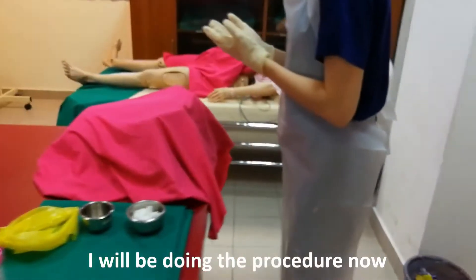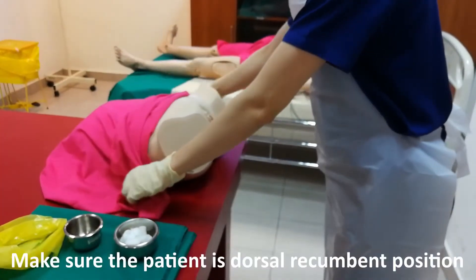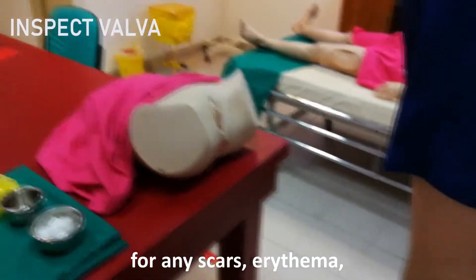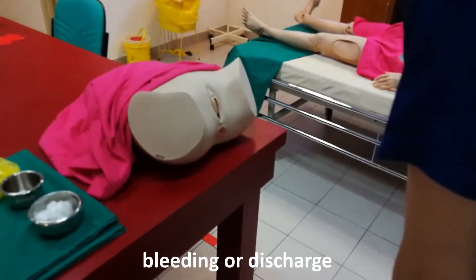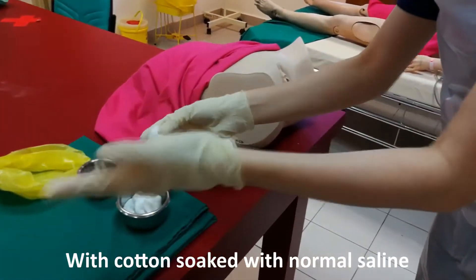Madam, we will be doing the procedure now. I would like to expose the perineum. Make sure the patient is in the dorsal recumbent position. Inspect the vulva region for any scars, erythema, bleeding, or discharge. After that, I will clean the perineum with cotton soaked with normal saline.